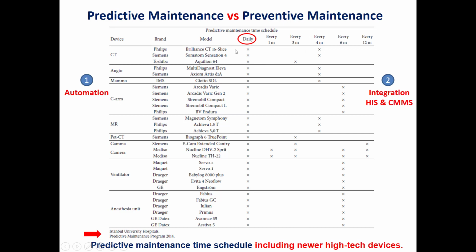So with a daily check-up of its condition, for example, in the case of the oxygen cell, we check the millivolt value. If it's close to 5 millivolts at 21% oxygen, which is in medical air, this means that we should change this oxygen cell. For this, we make a daily check-up for this component, and based on this, we recommend when this component will be replaced.